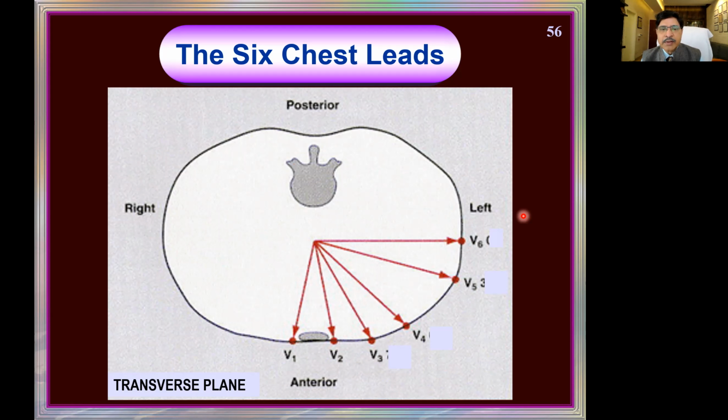Then we examined the apical impulse on the right side. So this is to impress on you, when the infarction features are there clinically and you are able to see a normal ECG on the left side, you have to do a right-sided lead. Then they are called V2R, V3R, V4R, just to show that they are recorded on the right side.